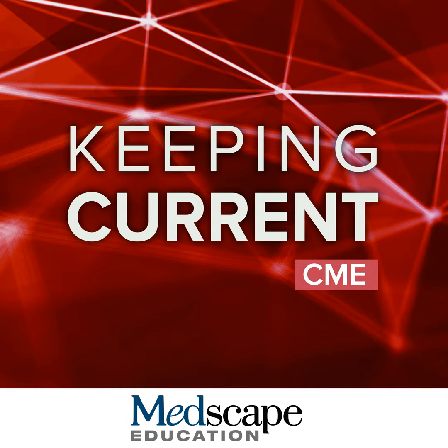But what if you took those purple squared sequences, the T2 weighted image, the diffusion weighted image, and the hepatobiliary phase, and created an abbreviated MRI based on this? Would this work? So that's what a hepatobiliary phase AMRI is. It's basically the T2 weighted image, the diffusion weighted image, and the hepatobiliary phase image.